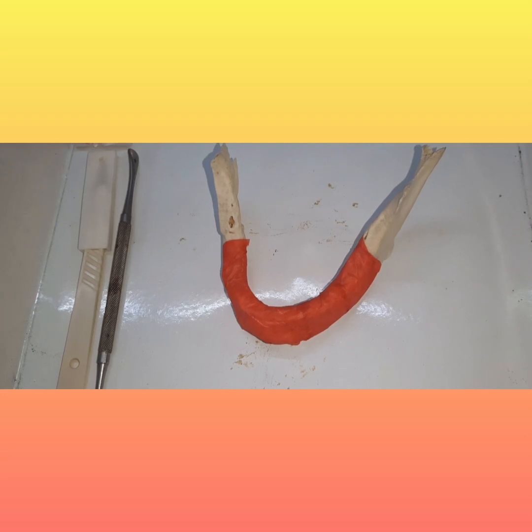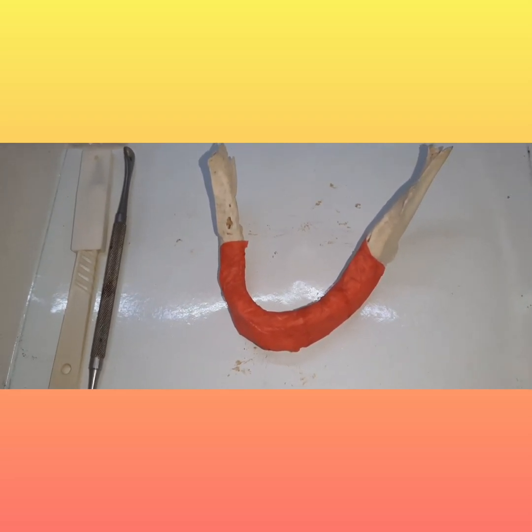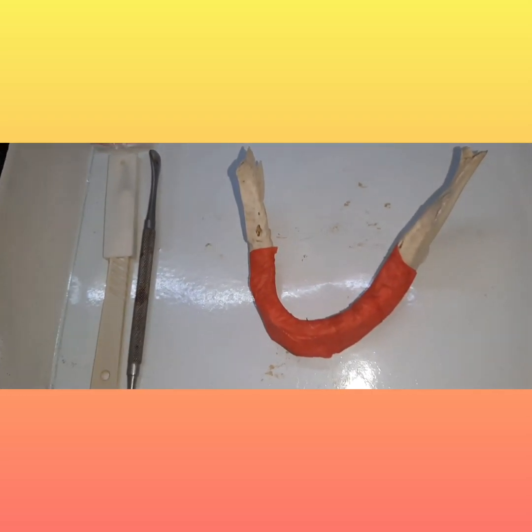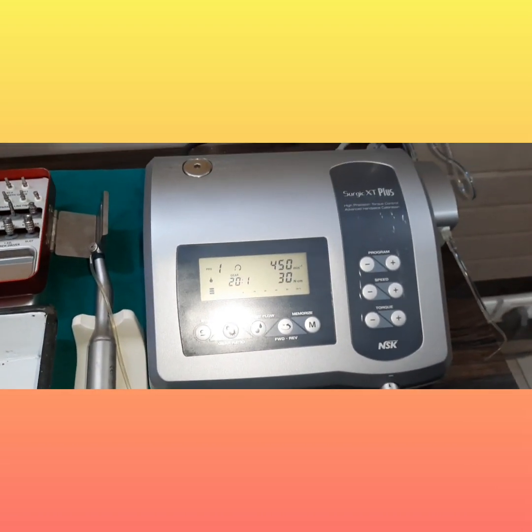So here we have not all the surgical kit, but the armamentarium which I will be requiring for the procedure. You have the surgical kit as well as the prosthetic kit here, the 3D printed model in which we are going to place the implant. Very briefly, your BP blade and your periosteal elevator and the entire armamentarium which is required for placement of implant, that is the physio dispenser.